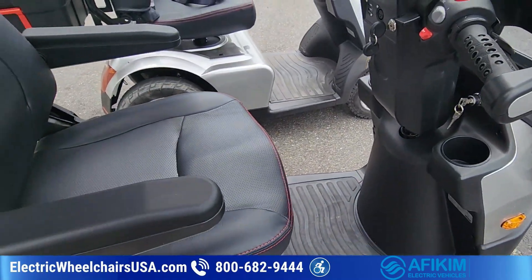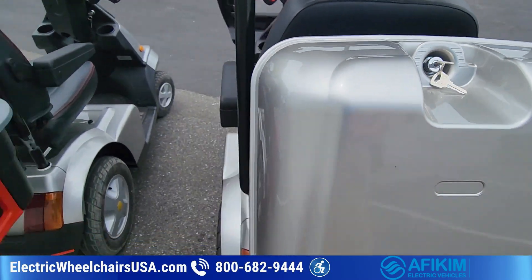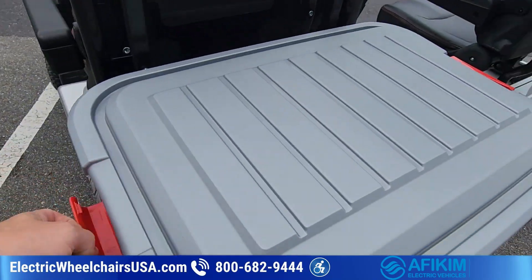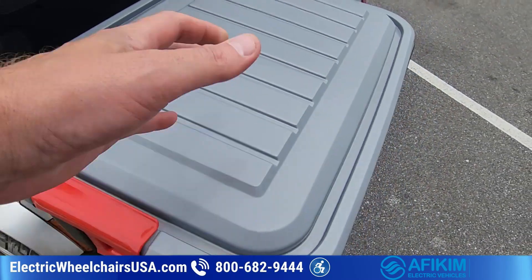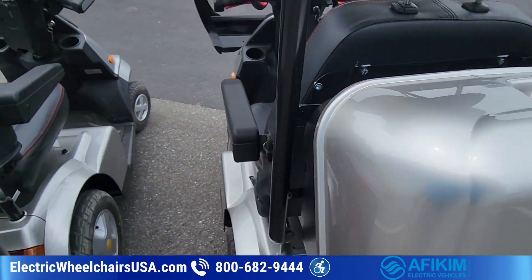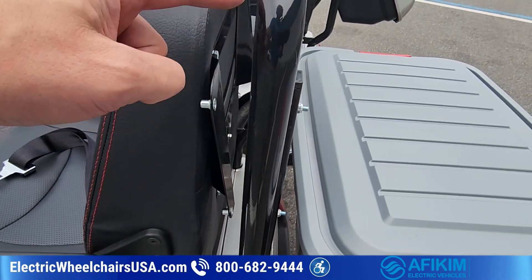The S3 and S4 come standard with a lockable storage compartment on the back, but you can upgrade to a storage tote to give you more storage space. The storage tote is significantly larger, but it's not lockable — you can clamp it shut so the lid doesn't come off, but you can't lock it. The standard compartment you can actually lock to keep your belongings secure.